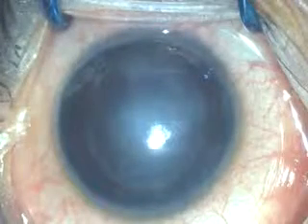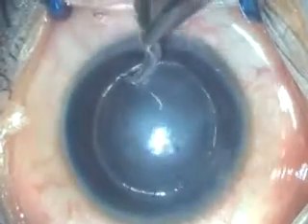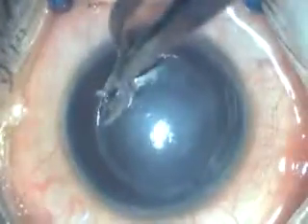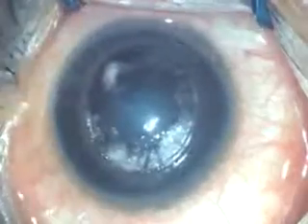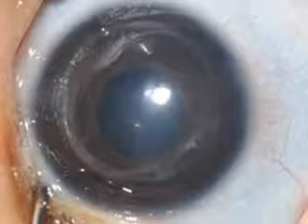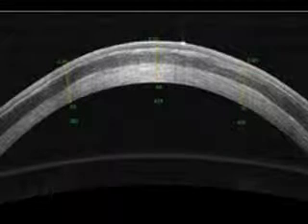Rarely, failure of the anterior lamellar graft can also take place. This, however, can be easily contended with, as the anterior lamella can be peeled off with relative ease and can be replaced with a suitable tissue. This is easily a much simpler and easier procedure than having to do a regraft in a failed penetrating keratoplasty. Thus, this simple technique of sutureless anterior lamellar keratoplasty ensures an acceptable outcome without the attendant complications and risks of sutures as in penetrating keratoplasty.